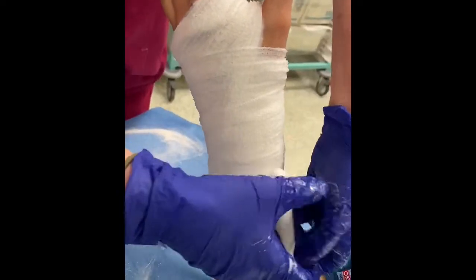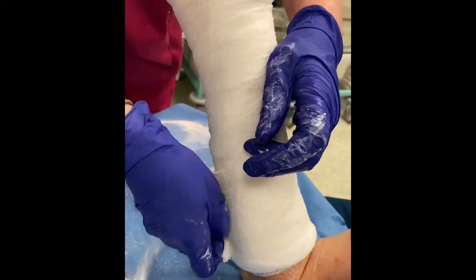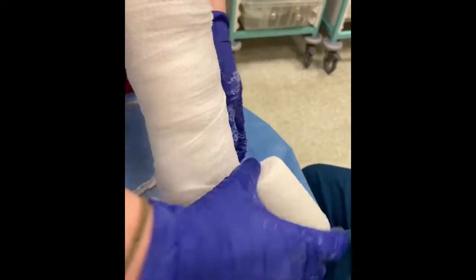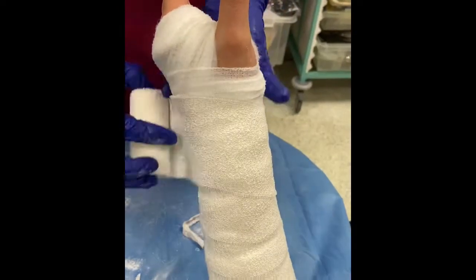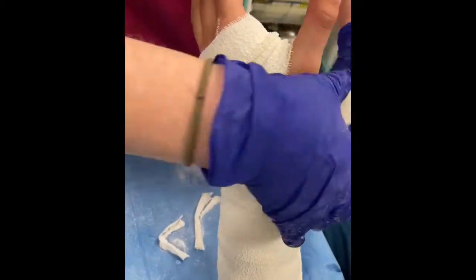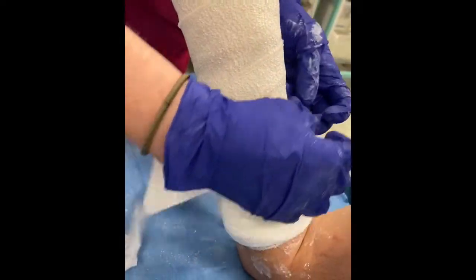One of the reasons that fibreglass is not routinely used in this particular procedure is that it sets very quickly and the opportunities to adjust it are minimal. The final crepe bandage goes over the top to complete the procedure. As the cast sets, it is mildly exothermic and the patient will feel that it is getting warmer, but they need to be warned that the cast will not fully set for several hours and if they flex and extend the wrist, it will break the cast and make it useless.